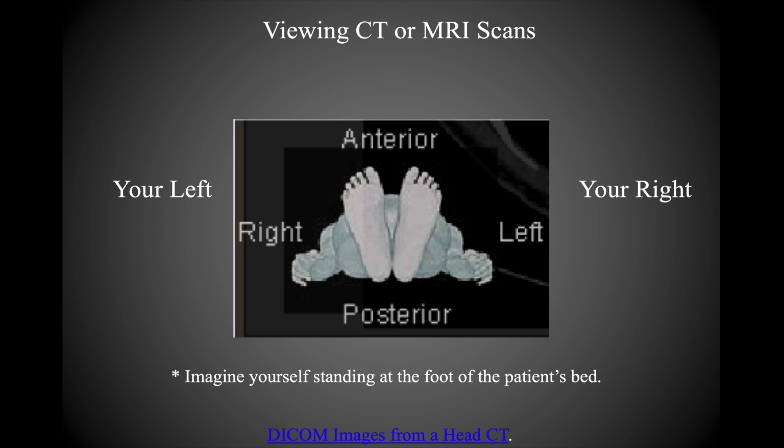And so it's crucial to know how to look at these slices, which again, I've alluded to a little bit, but there's a couple of key things to keep in mind. Cross-sections from CT scans, and this is the same for MRI as well as for ultrasound, are going to be viewed as if you were standing at the feet of the patient and looking up towards their head, okay? So that means the right side of the screen for you is always going to be the patient's left, and the left side of the screen for you is going to be the patient's right.